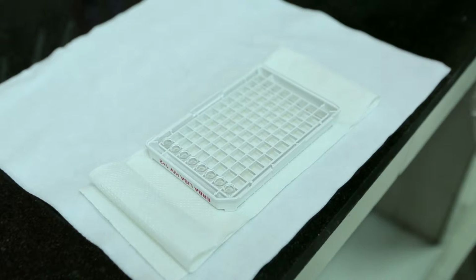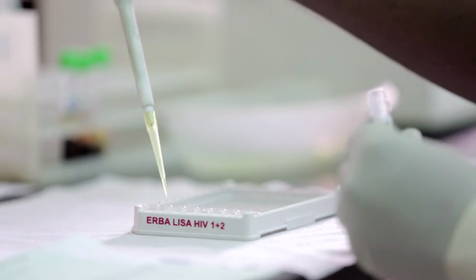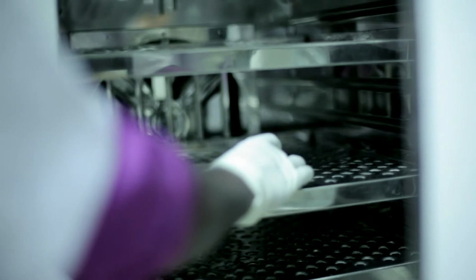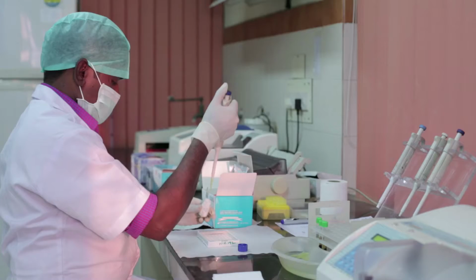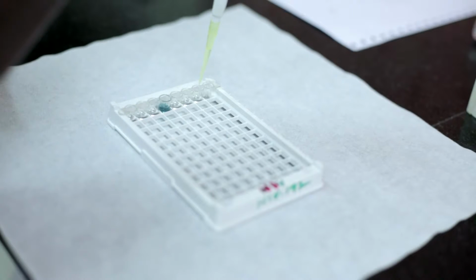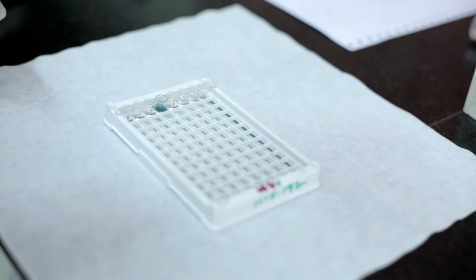Invert the plate over a tissue paper and dry it by gently tapping. Then add enzyme conjugate and incubate again. Repeat the washing step. Meanwhile, prepare the enzyme substrate and keep it ready. Dry the microplate and add enzyme substrate to the wells as per instructions. Add stop solution to fix the color developed in the wells.